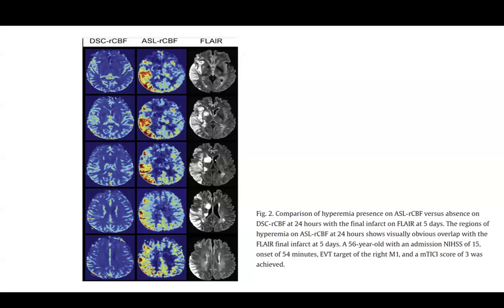ASL actually has more specificity as far as execution is concerned. The problem is that it has to be done with multi-delay ASL.